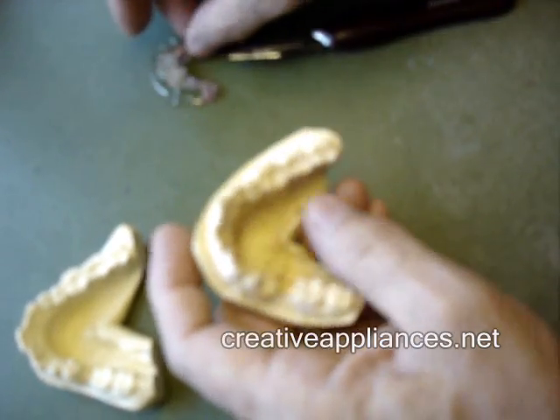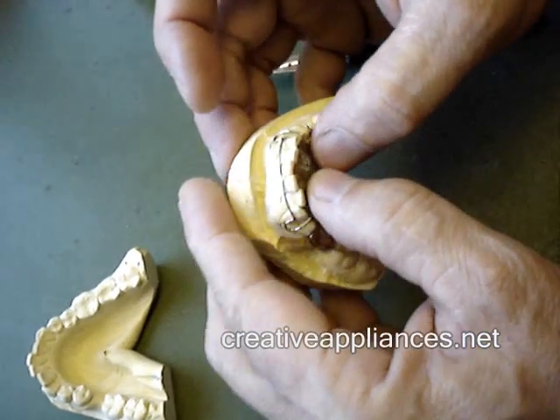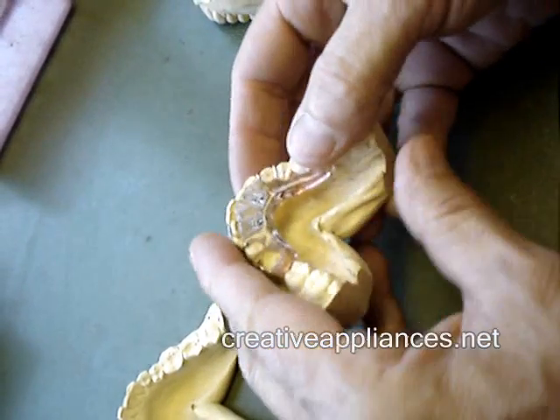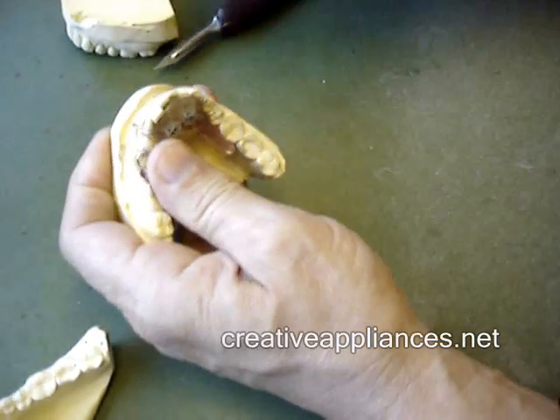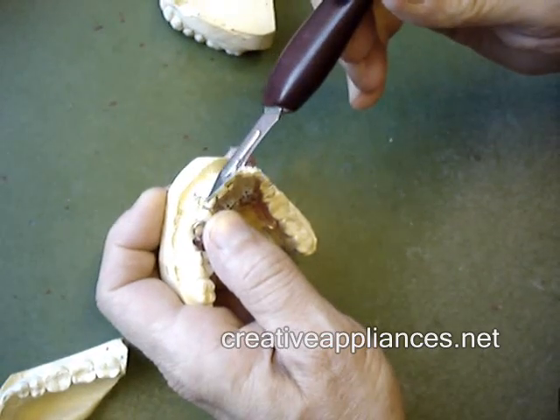This is the construction model. You can see how the appliance snaps into place — fits tightly and snugly. It's up off the palate so she doesn't have any irritation there, and the bow is placed in the perfect position.